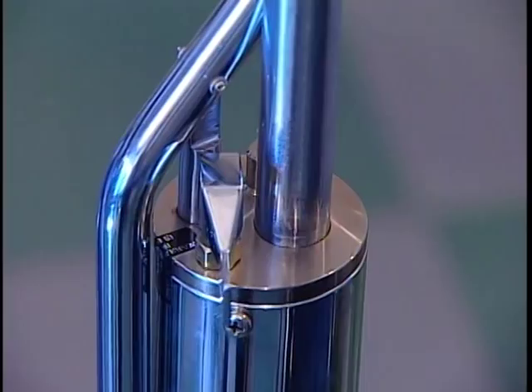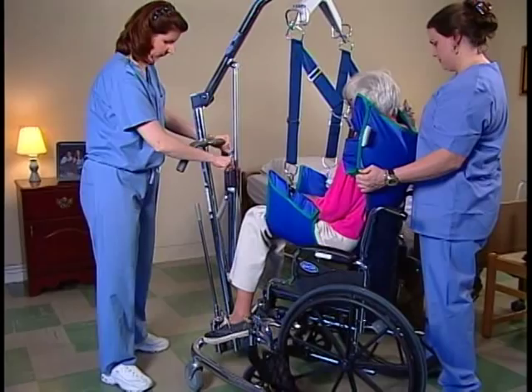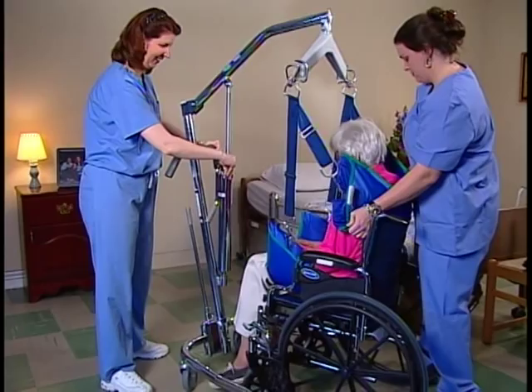Open the control valve to lower the patient onto the chair. Turn the resident so that their back is against the back of the wheelchair. The second caregiver should position themselves behind the wheelchair and guide the resident so that their hips are as far back into the seat as possible. This will keep the resident from slumping in the chair. Remove the straps and pull the lift away.